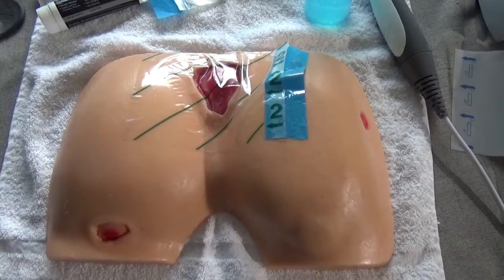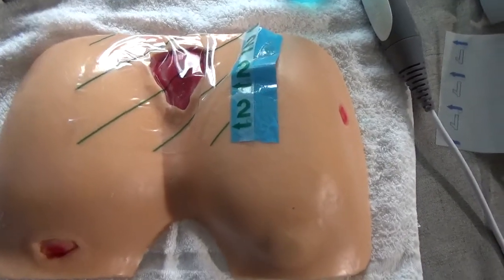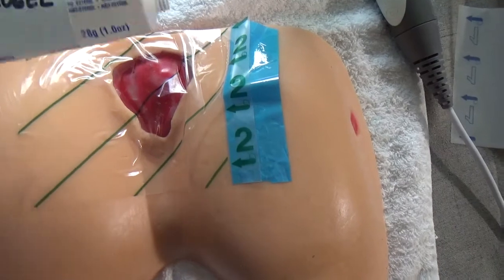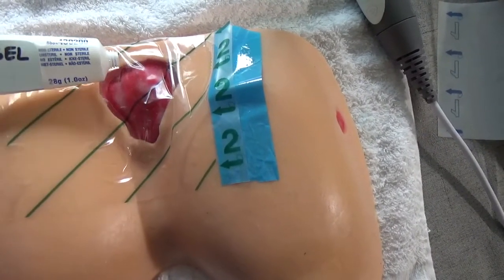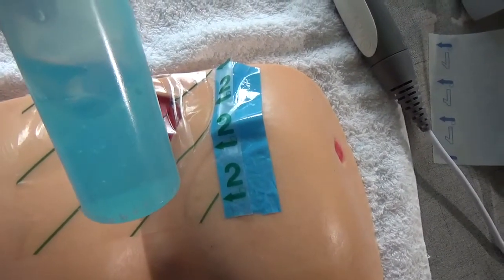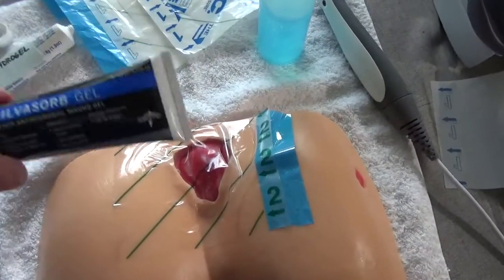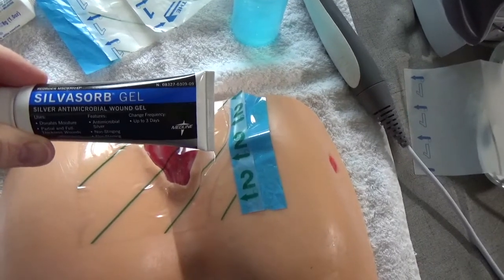So far, the dressing to this wound has been removed. The wound has been irrigated with saline. We have applied a clear hydrogel inside the wound. We did not apply ultrasound gel inside the wound. We did not apply Silvasorb with silver inside the wound.